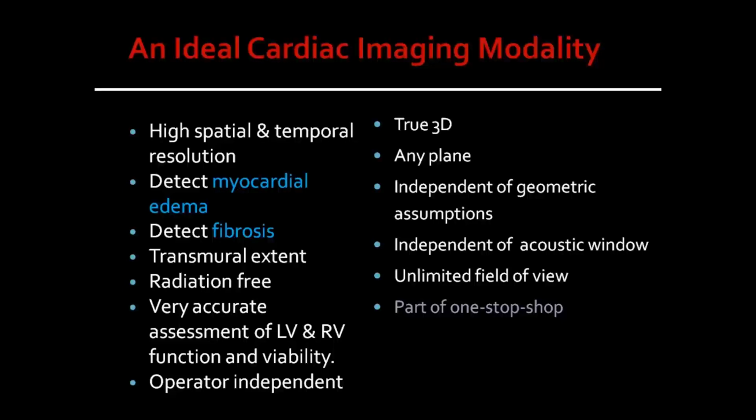Also, if it's a gold standard or a very accurate tool in assessment of LV and RV function, and best of all, if it's operator independent. We know that echocardiography is operator dependent. So if we had an imaging modality that is independent of the operator, that would be excellent.